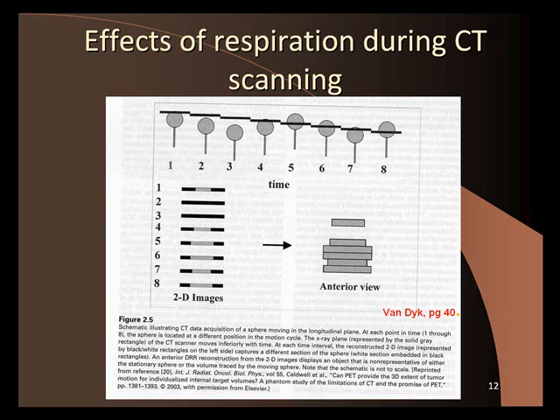Okay. And so in the old days, before we had any kind of 4D-CT or fast scanners, we would say, well, this patient has lung cancer, we could do a CT scan and we can kind of see where the tumor is. I mean, it's not that obvious, it's kind of blurry. So we'd see where the tumor is, and the doctor would put a big margin on it. And say, well, I know this tumor is going to move maybe up to 2 centimeters due to breathing. So I'm going to put a 2 centimeter margin, and I'm just going to treat this big block of tissue. But I know I'm going to hit it. I want to make sure there's no recurrence, and I want to hit it.